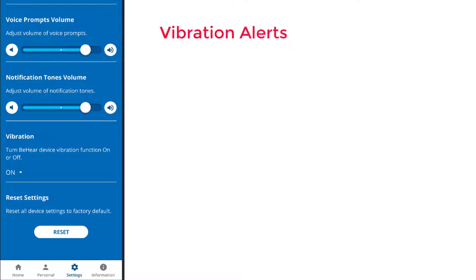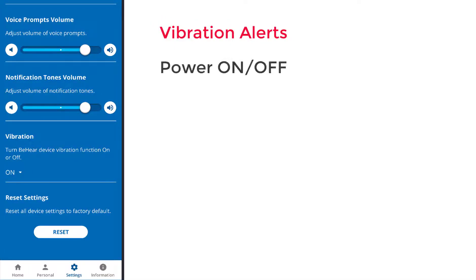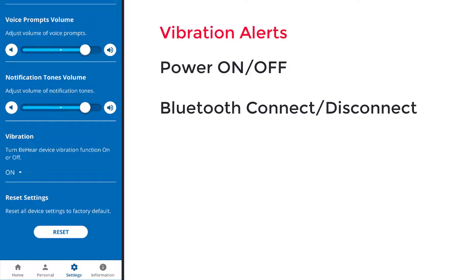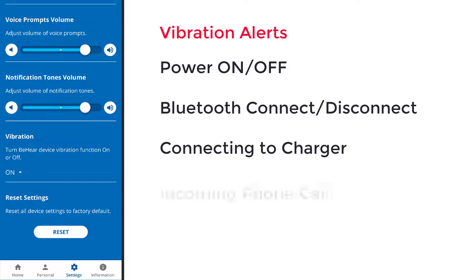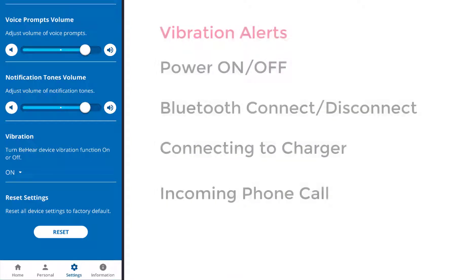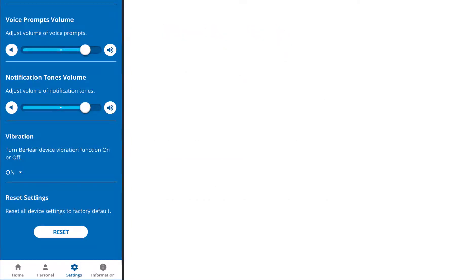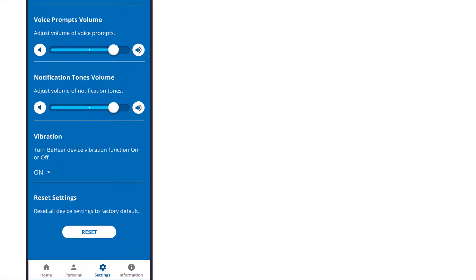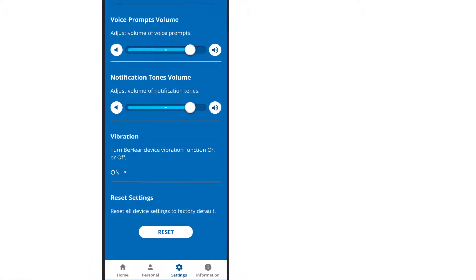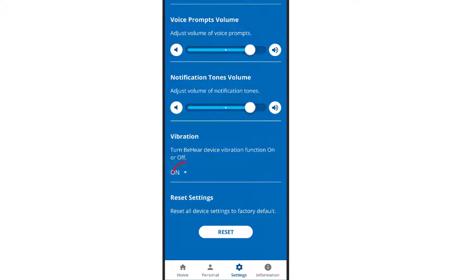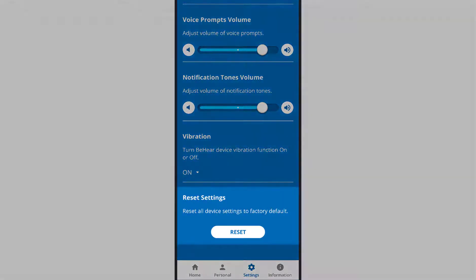Headset power on and power off, Bluetooth pairing, connection, disconnection, connecting to the charger, incoming call, synchronized with call tone. You can choose either on or off. The default setting is on. This is also the place to reset all device settings to their factory default.